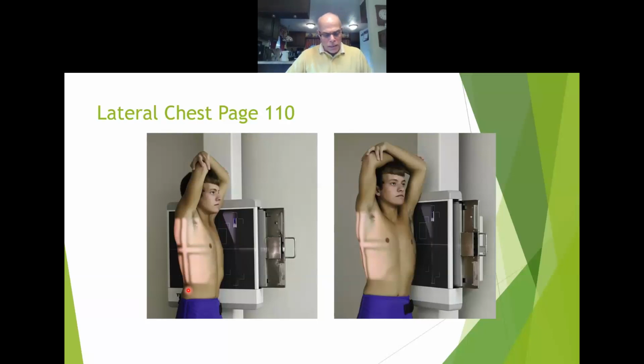Respiration, we've talked about central ray, we've talked about collimation. Again, adjust radiation field to 17 inches lengthwise. And then you're going to start collimating it anterior to posterior. I think it says 1 inch. Yeah, 1 inch beyond the anterior and posterior shadows, but no more than 14 inches. So don't get too tight, but you still have to collimate it in from front to back.